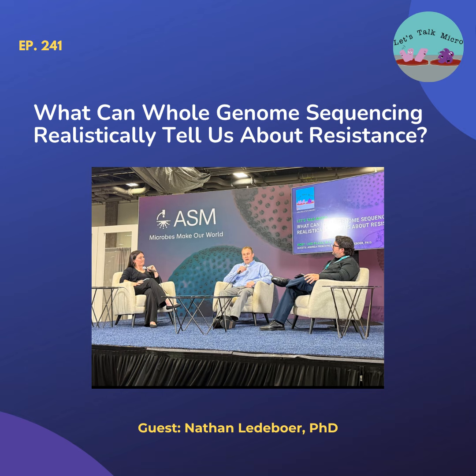Well, I think the biggest challenge today is all of this work is still being done in the lab developed test space or in the research use only space. We have not seen as much movement as I had hoped in terms of getting FDA cleared solutions in this space. I do think that within 1 to 2 years, we will have a couple of FDA cleared NGS based tests, both direct from specimen as well as from isolates. So I think the regulatory process has slowed things down a little bit.